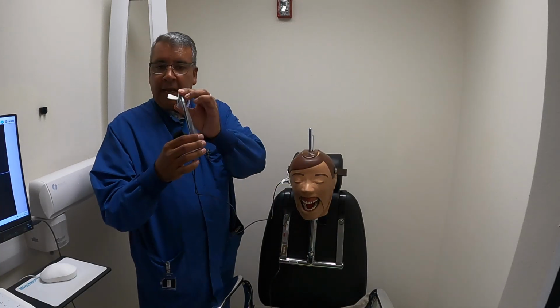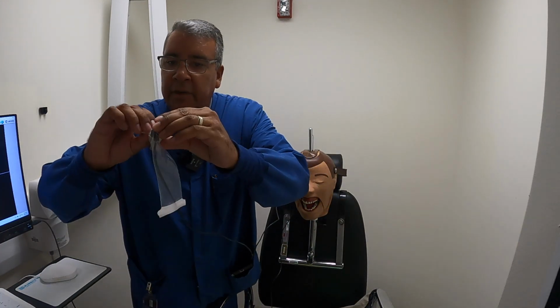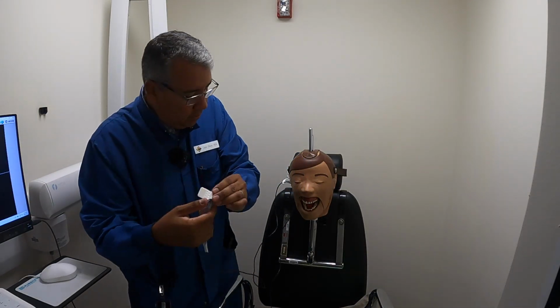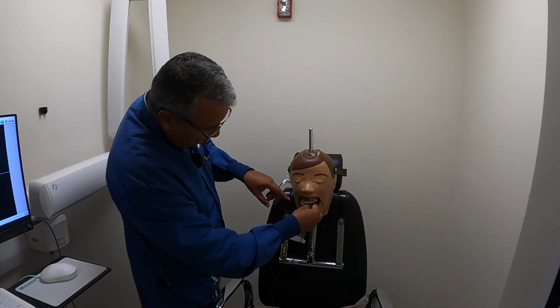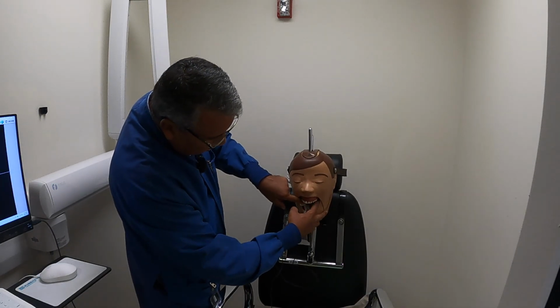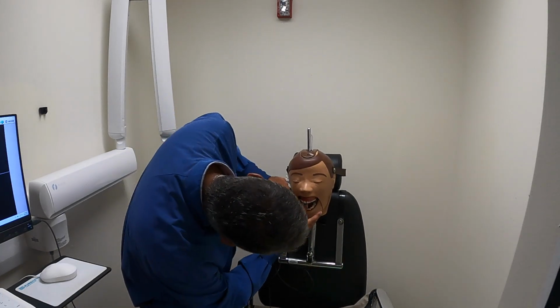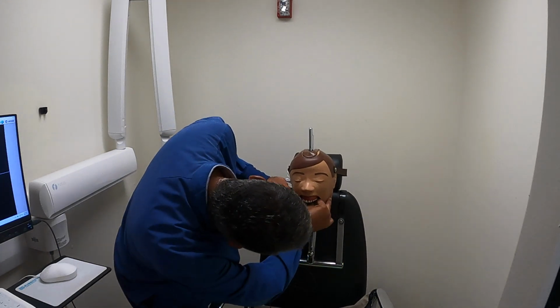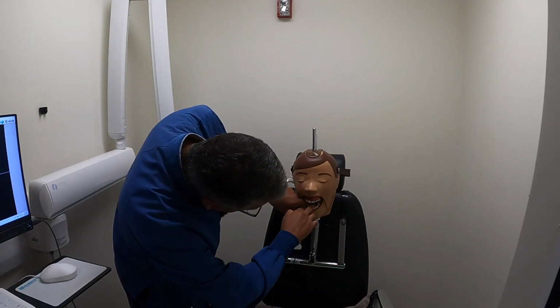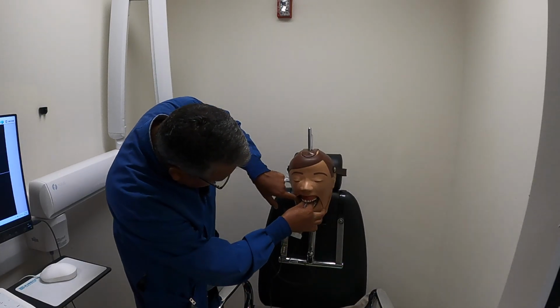So notice how that kind of bit also, it looks a little twisted. So you may have to sit there and adjust it to where it's still centered, an equal amount on top, an equal amount on the bottom. Okay, in the patient's mouth, take that tongue and move it out of your way, because if it gets caught under the sensor, sometimes it wants to put pressure up, and you wind up with more of the maxillary than you do of the mandibular. Okay? And this patient is not working with me. Move over, patient. Give me that tongue. Okay.